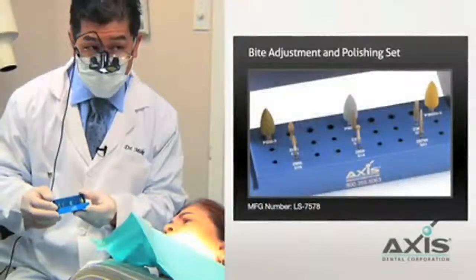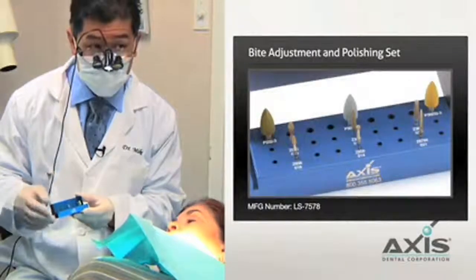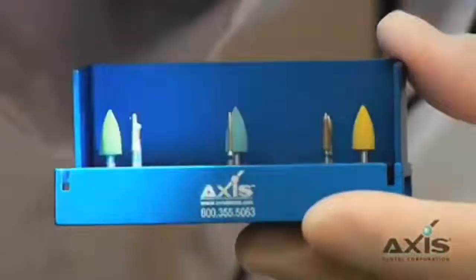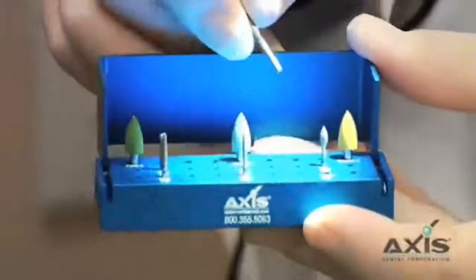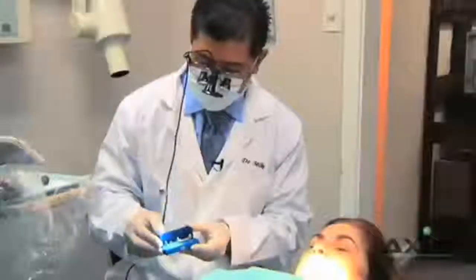This kit has some very nice long burrs, which are great for recontouring and getting the long flat planes of a tooth. You could also use this to post-cementation adjust veneers and crowns, and you can get down around the gingival margins and do some trimming. I like the football burr to adjust the lingual sides of crowns or veneers. It's a very nice kit.